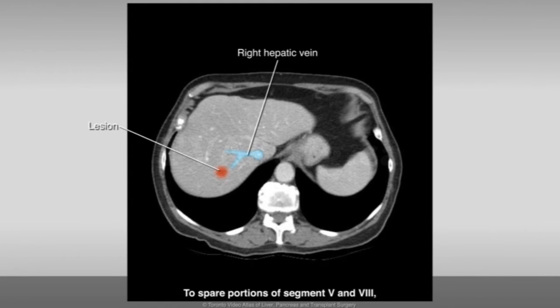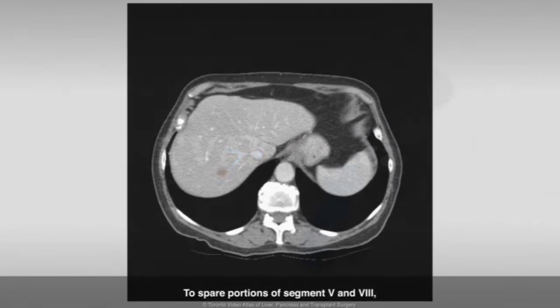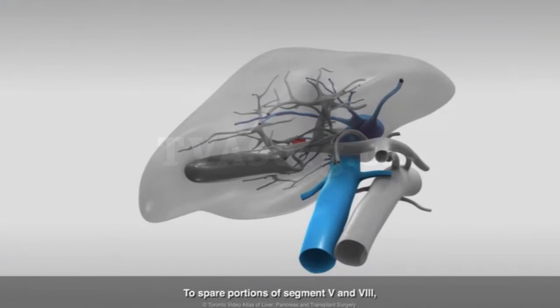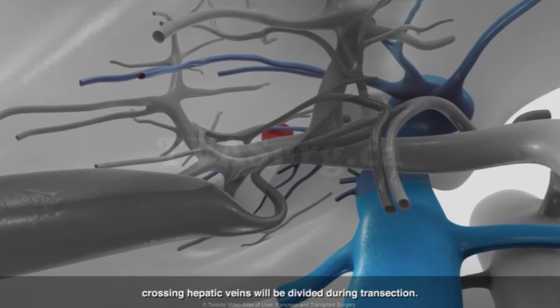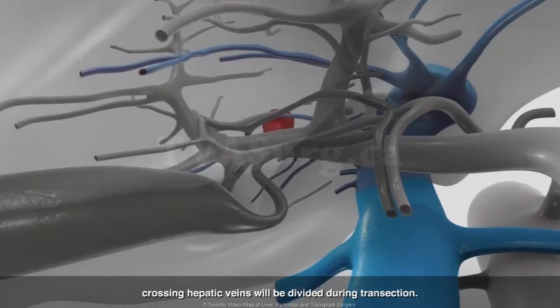To spare portions of segments 5 and 8, crossing hepatic veins will be divided during transection.